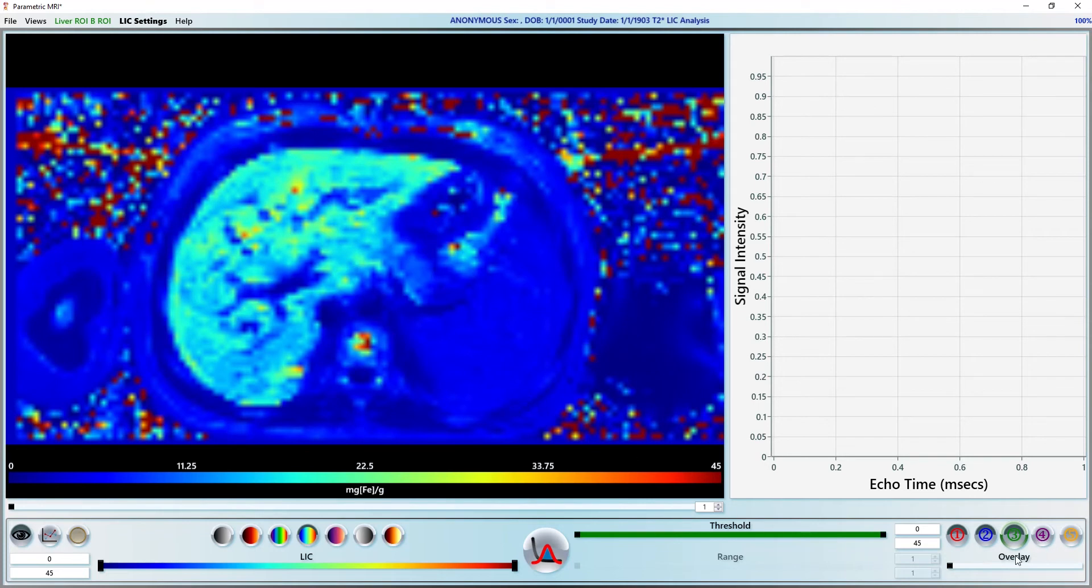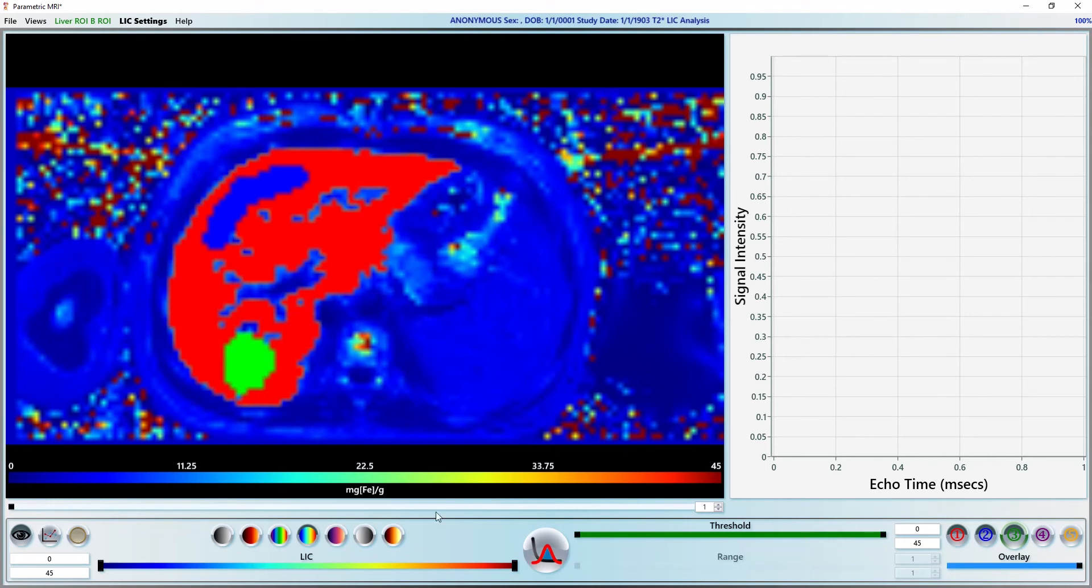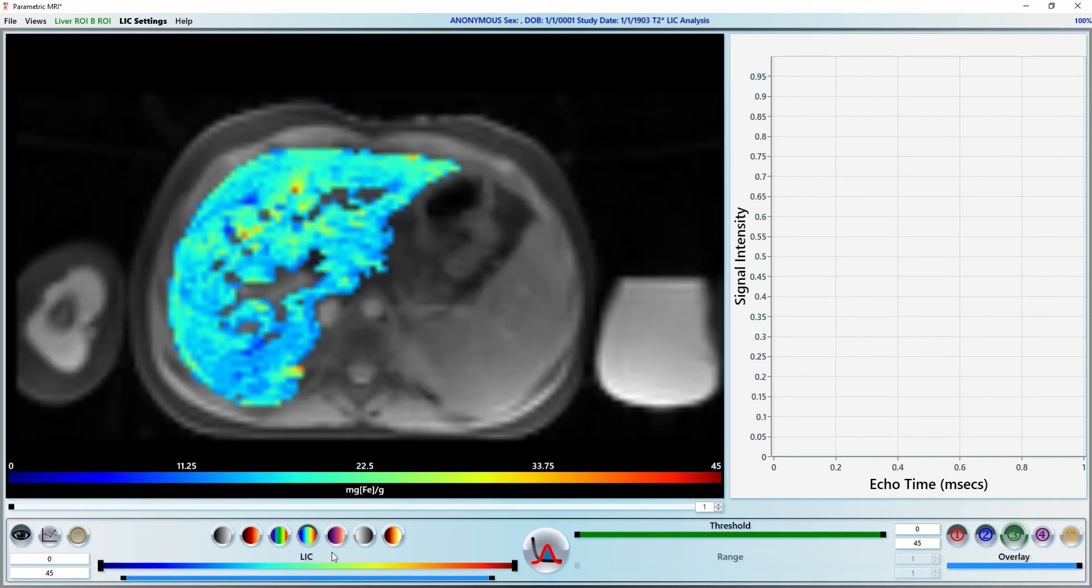Alternatively, we can turn the overlays back on and right click on the window leveling slider to show the map as an overlay.